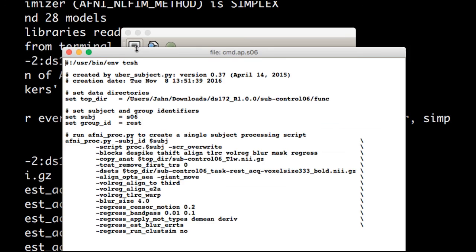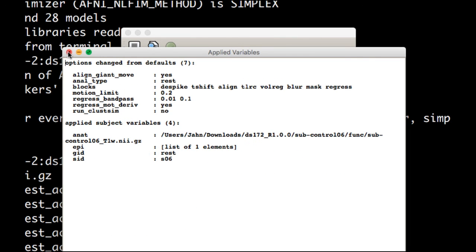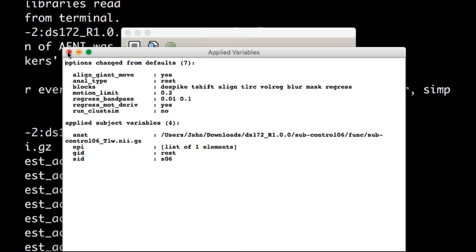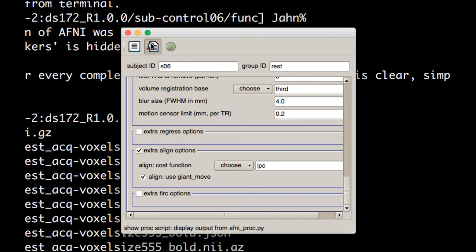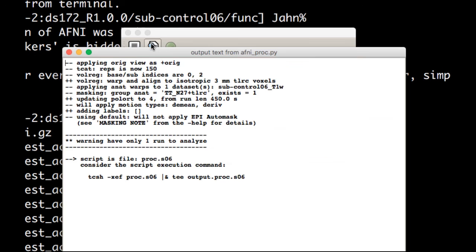Once you've done all that, just click on this first button here. It shows you what AFNI_PROC.PY script is going to run. And that's going to be saved out in a file that you can look at later. It'll show you what options have been changed. And then you click on the next button to then generate that script.